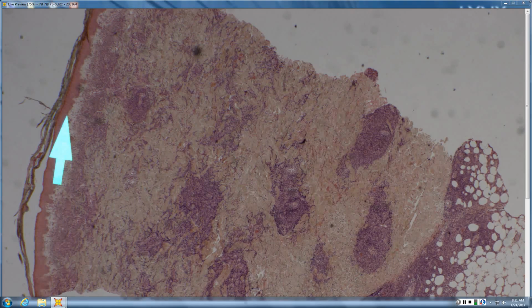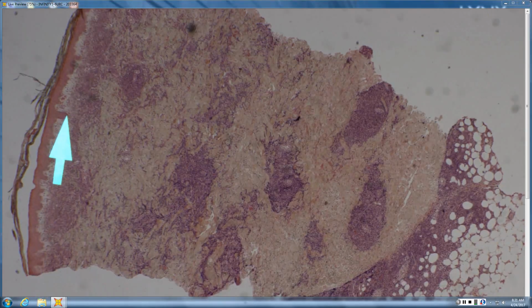Gamma delta lymphomas often have lots of necrotic nuclei, so lots of dead and necrotic, especially in the subcutis, lots of pyknotic nuclei. The NK lymphomas are often angiocentric, angiodestructive, so they often ulcerate, and have less commonly red cell extravasation, because it's usually more vascular damage, so you get whole-scale tissue necrosis rather than just erythrocyte extravasation.